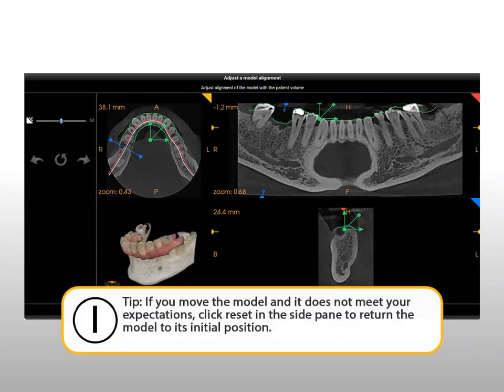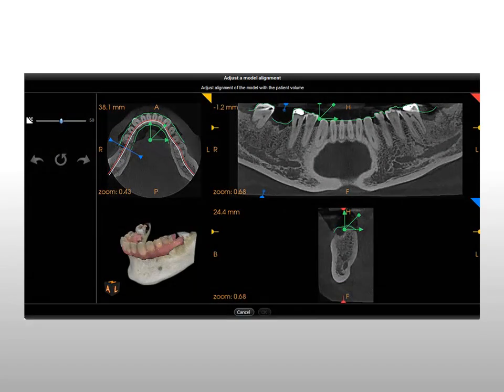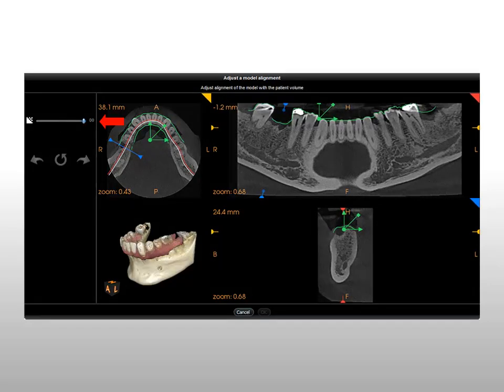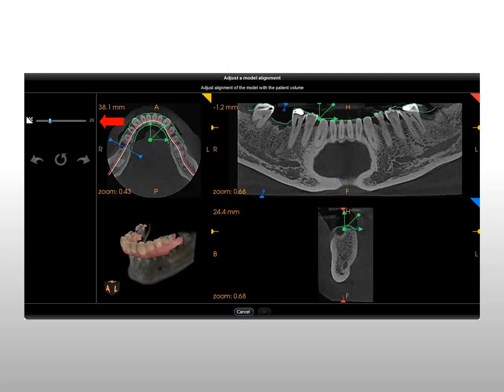If you move the model and it does not meet your expectations, click Reset in the side pane to return the model to its initial position. In the Adjust a Model Alignment window, the opacity of the 3D View screen is set to 50% by default. You can modify this setting to better highlight the relative position of the model and patient volume by clicking and dragging the slide adjuster in the left-hand pane.